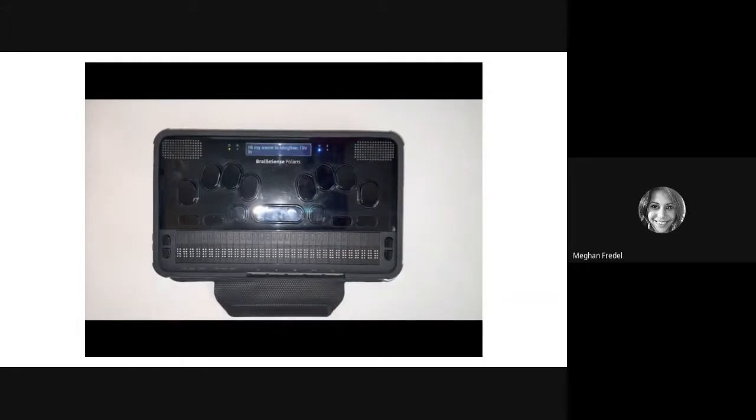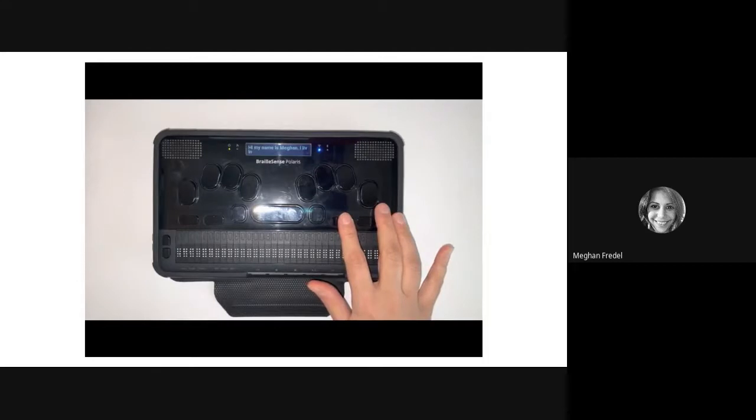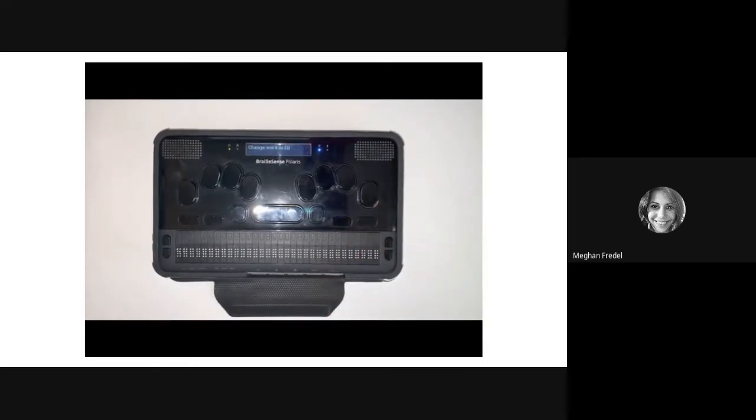So when it runs spell check, it's going to say the word that it thinks is spelled incorrectly. And the first word that it's found for me is "live," which I have spelled L-I-V. So next, when you come upon a misspelled word, you're going to press tab. Change word live edit box.